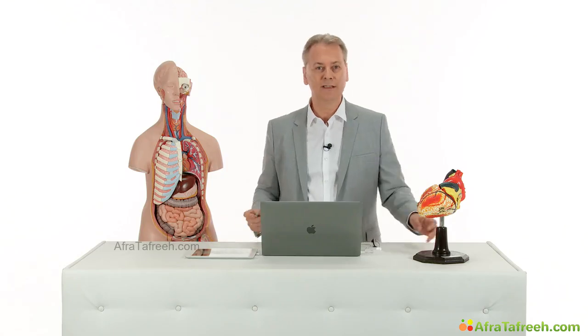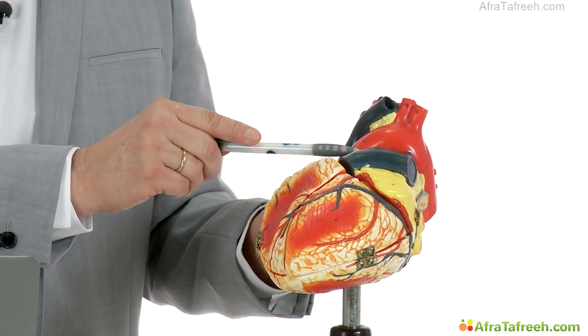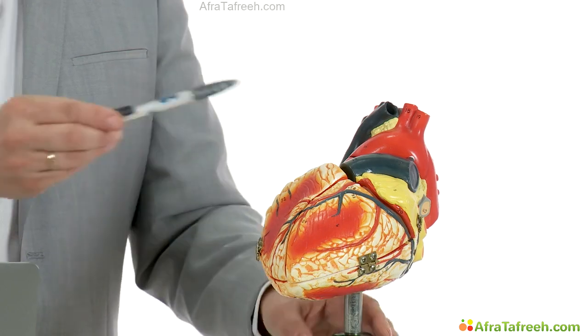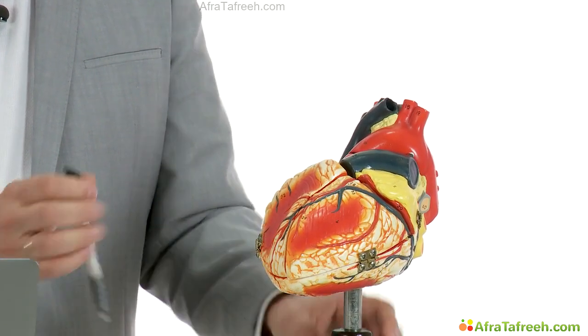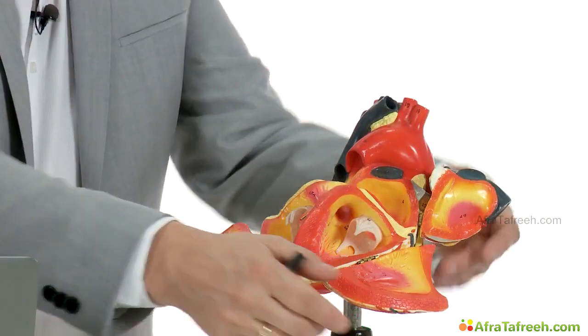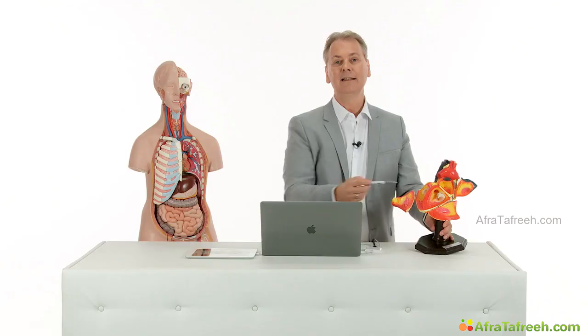If we look at the heart in more detail, we will see the base of the heart right here. This is the cranial portion. Here the great vessels enter and leave. Here would be the mid portion, and this is the apical portion of the heart. If we now open up the chambers, we will see that the apex is actually formed by the left ventricle, at least in normal, healthy individuals.